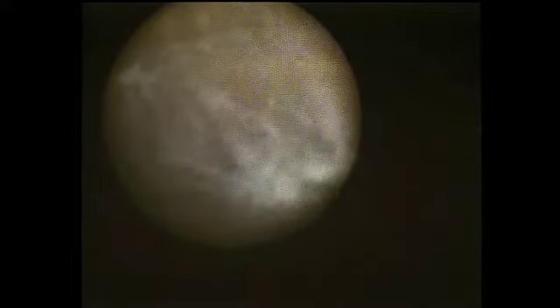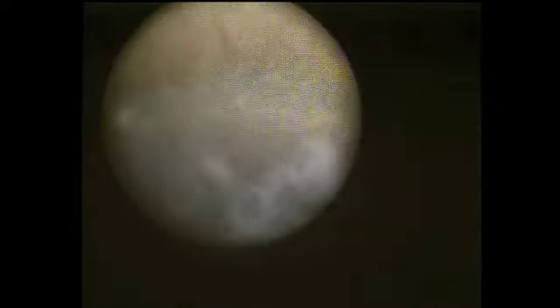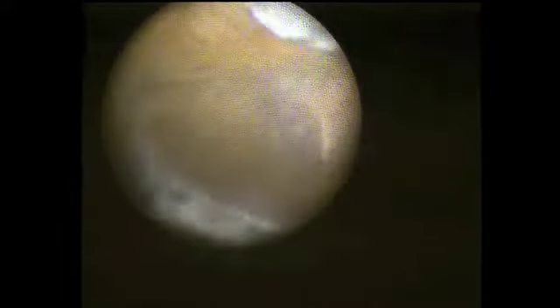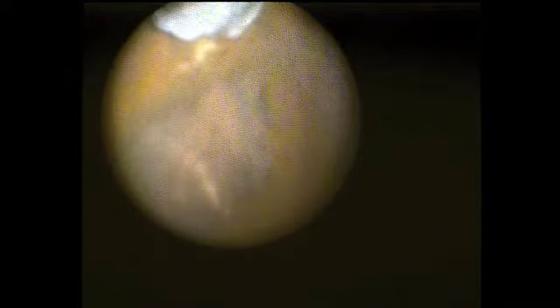Again, the peripheral area. I am trying to locate the foreign body. Here you can see the iron foreign body lying at the pars plana region. This localization was not possible easily with the conventional system, even with depression.